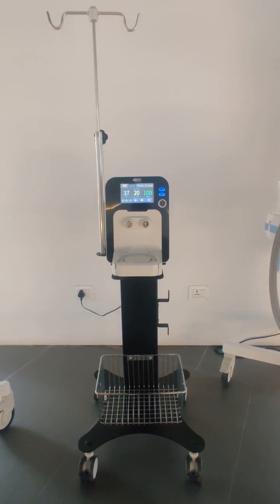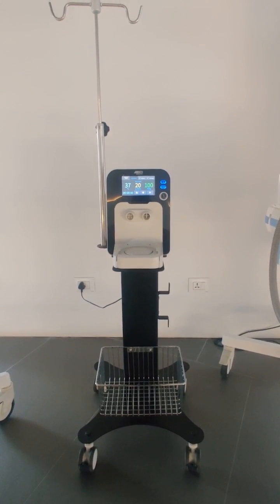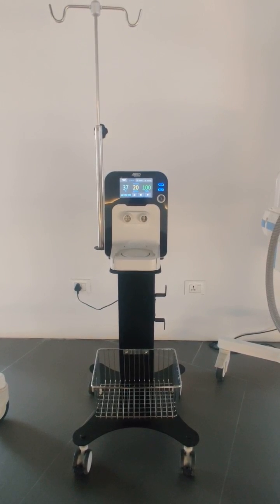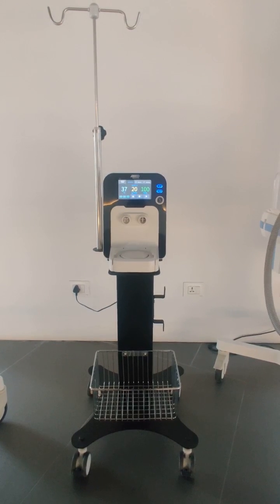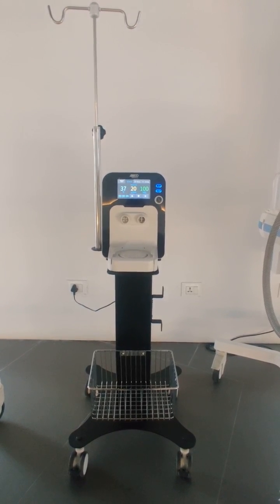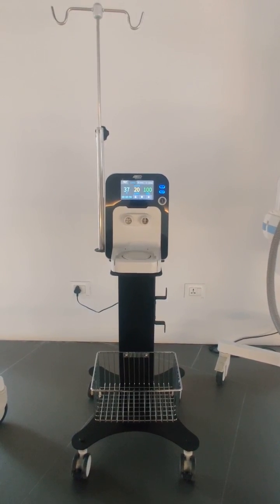In this video we will be discussing the Allied HFT, which has a built-in turbine technology and a 5-inch touchscreen with color display. You can operate it via touchscreen or the knob. On the screen you will get parameters that can be set and monitored, which I will be discussing in this video.